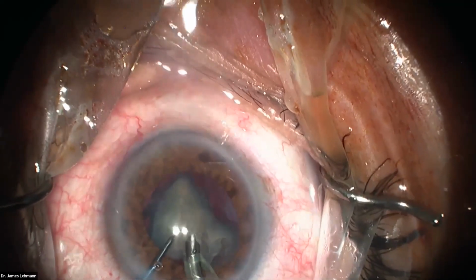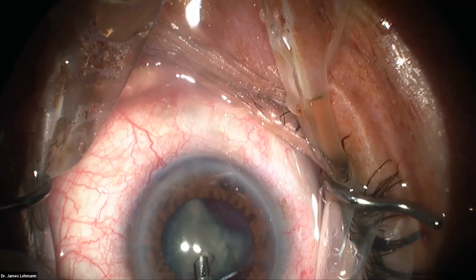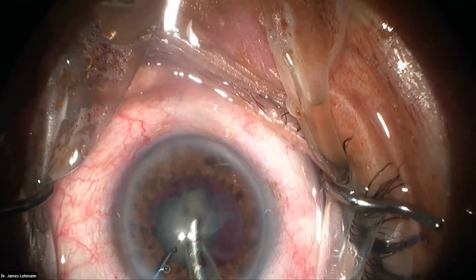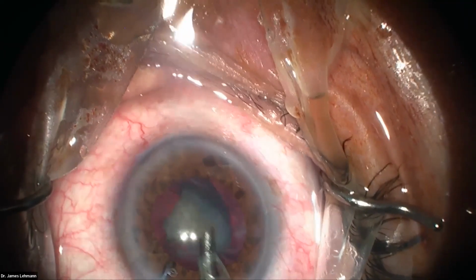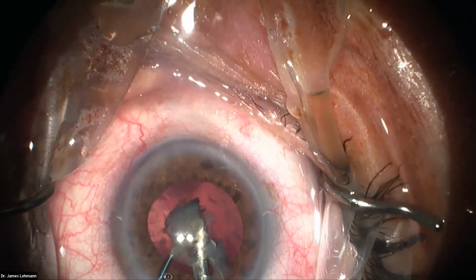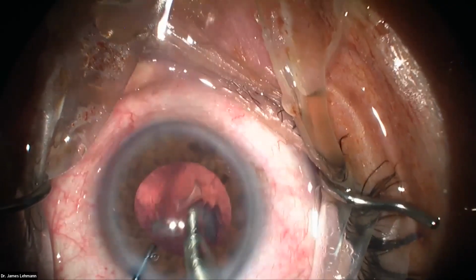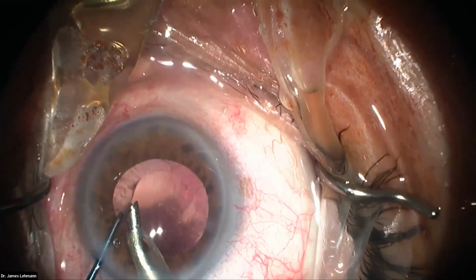And then now, how do I get this one? I'll stop phacoing. I'll move my second instrument and I'll throw it back in front of it like that. Not twist my phaco tip around and try to do gymnastics with it. And then here we've got the same thing. Just this last little piece. And then, you know, with modern phaco machines, you don't have that post-occlusion surge like you used to have, where you're getting that last piece and then everything comes forward.